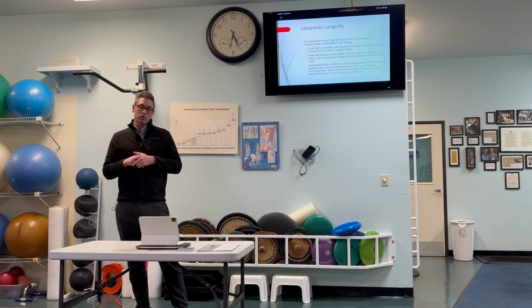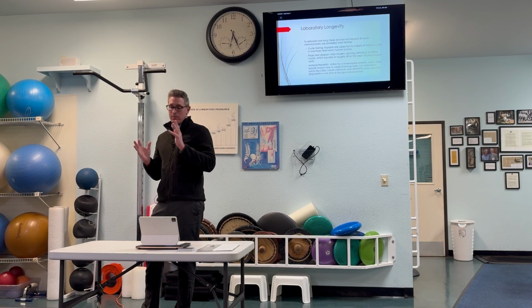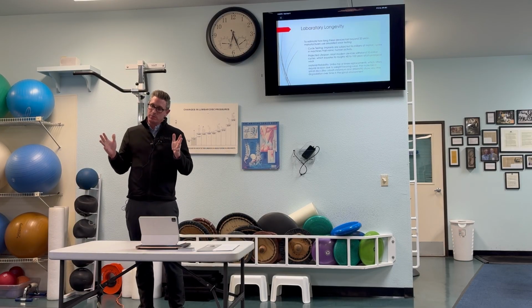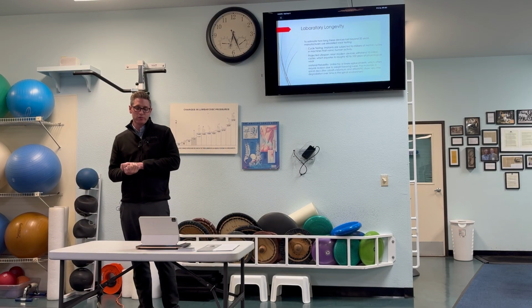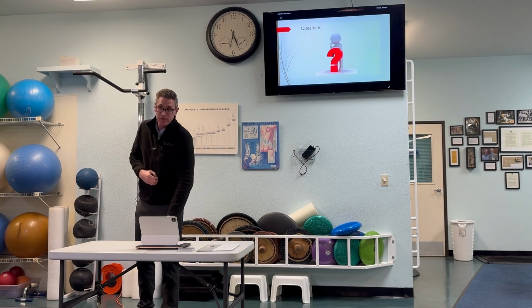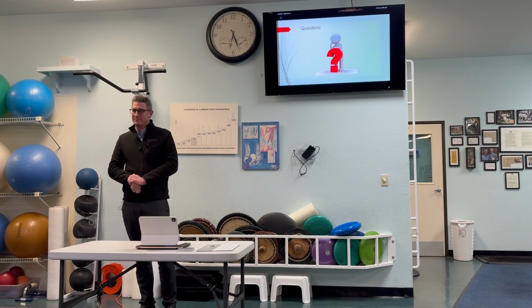So I think that bodes well for longevity of a total disc arthroplasty. And they run these through 10 million cycles, which they believe is about 40 years of wear in a human. So the longevity of this should be about 40 years, if not more. So I thought that was quite an interesting fact as well. And that's it. Any questions? I know it's a lot.